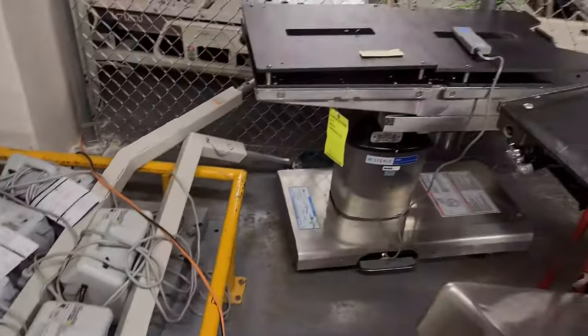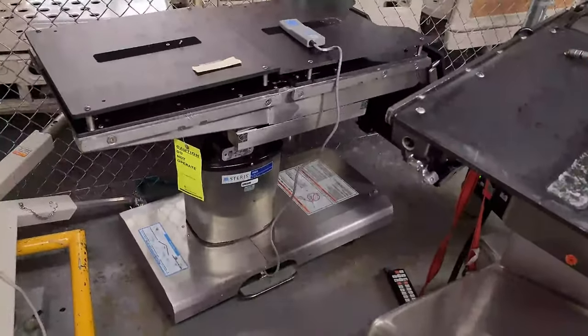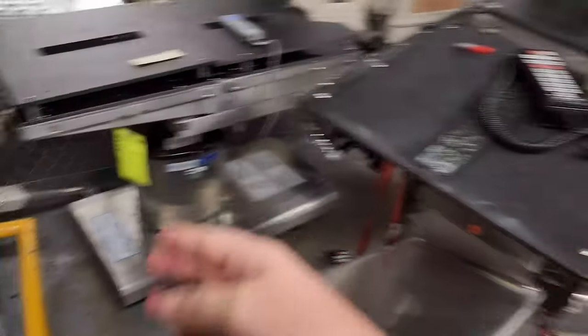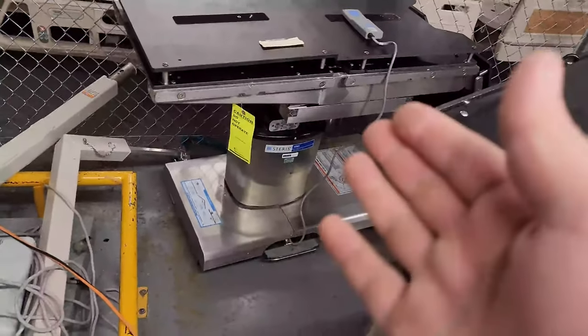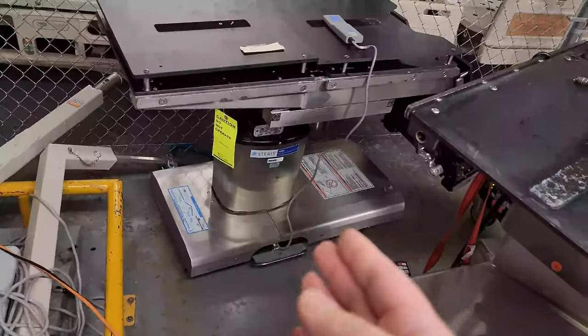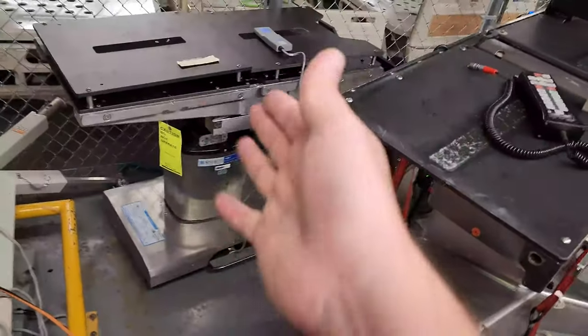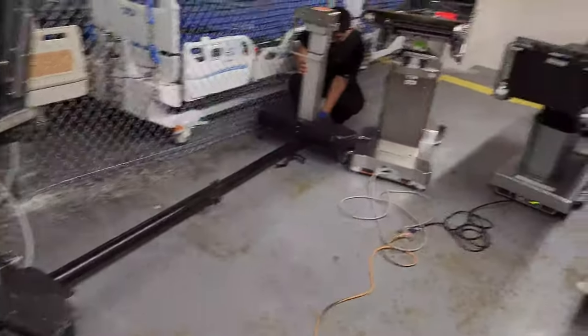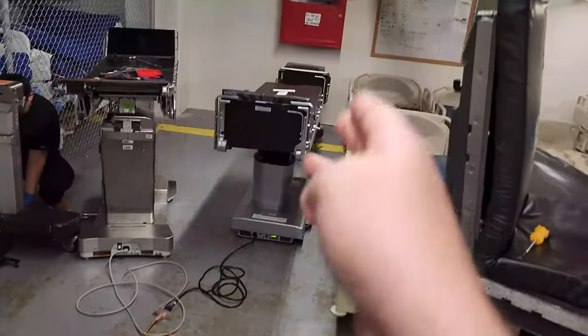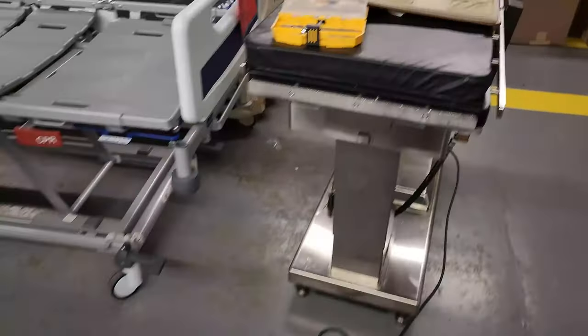I have another Stryker 4085 over here — this is the original owner of the cracked LCD screen. As far as I can tell the table seems to be working absolutely fine, but it probably needs a full inspection once we get the hand control. Without a proper hand control it's useless to proceed, because if the users can't use it, it can't go into service anyway.